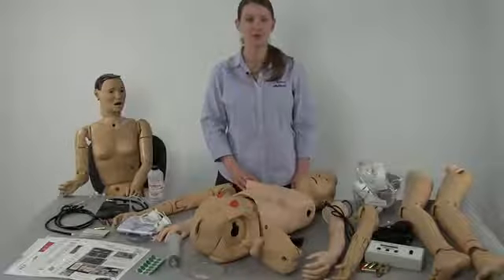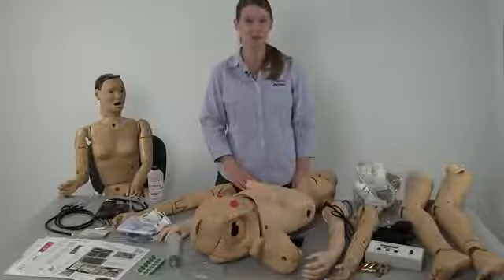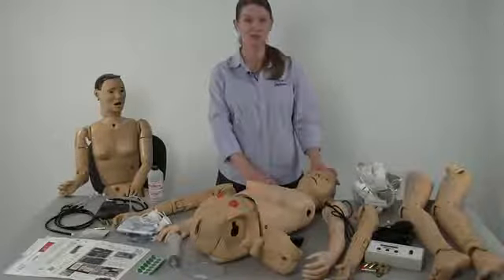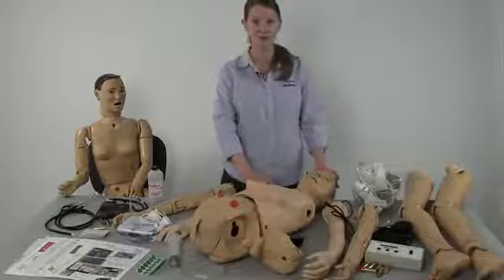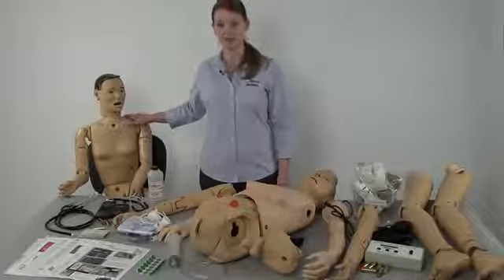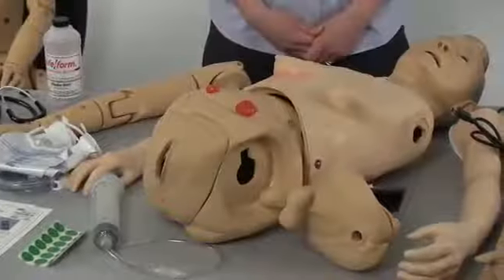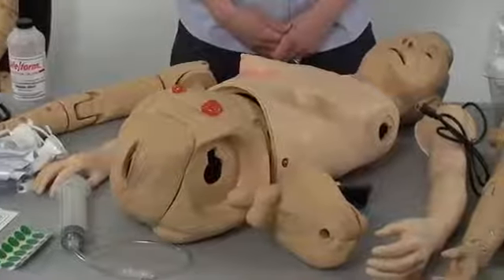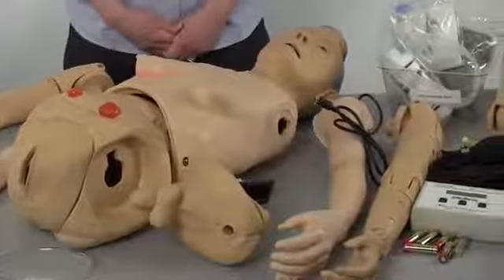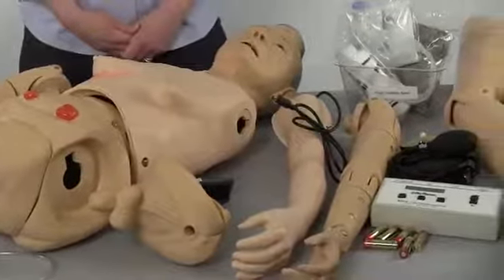Thank you for your purchase. This is an instructional video for the elderly appearing Advanced Auscultation Jerry Mannequin or the young appearing Carrie Mannequin. What you see on the table are all of the components that comprise the most advanced version of the Jerry or Carrie Mannequin line.